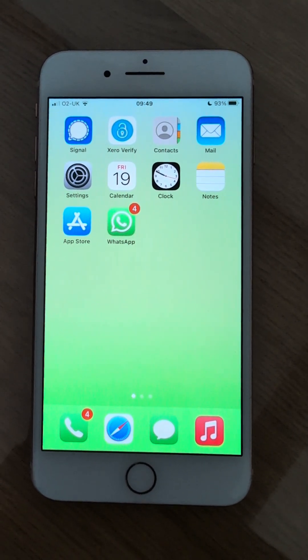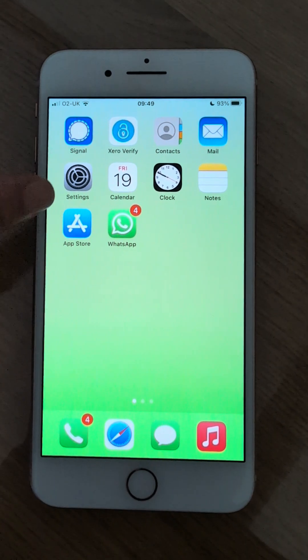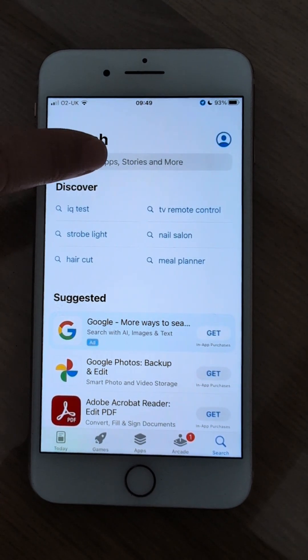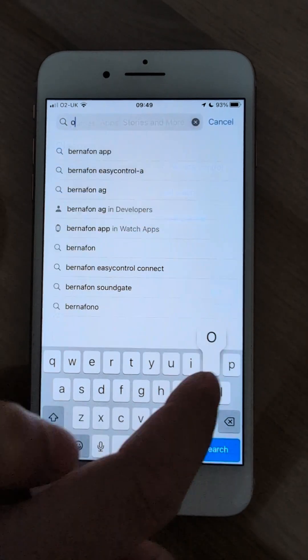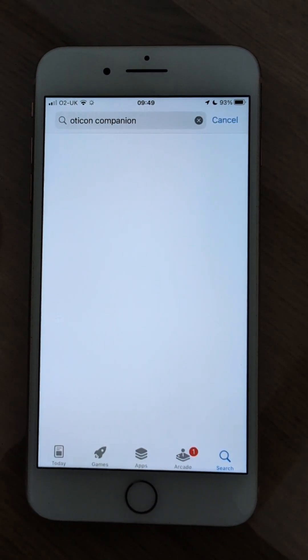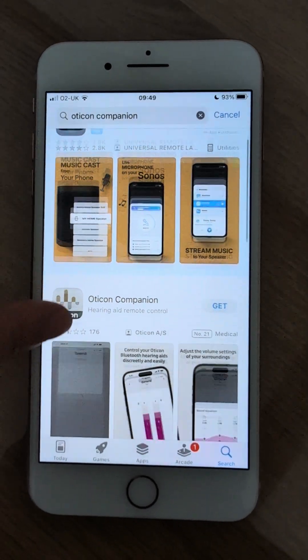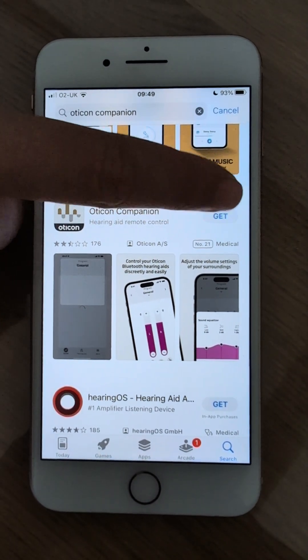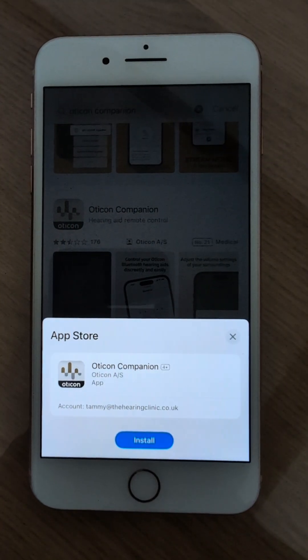First of all, you're going to find your app store on your phone and search for Oticon Companion. Once you've found that, click and scroll down — here is the Oticon Companion app. You're going to press Get and Install.